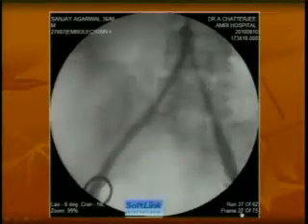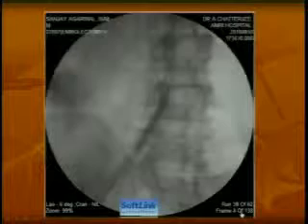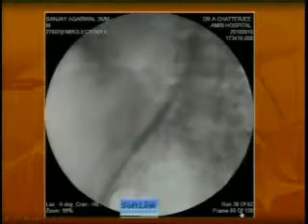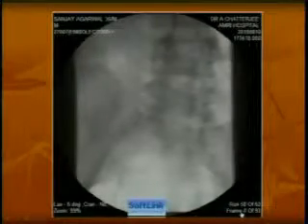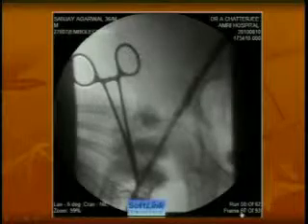After that, we did an angio, but thought that there may be some residue, the atheroma or something there. So I took a balloon and gradually drew out, and a small amount of atheroma dislodged, probably when I was coming back into the true lumen, that came out. Subsequently, we checked the flow, and it was good all the way.